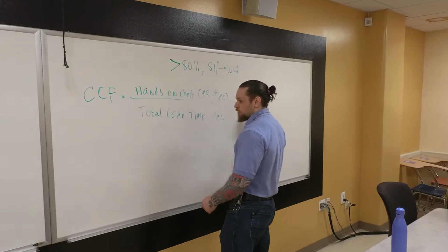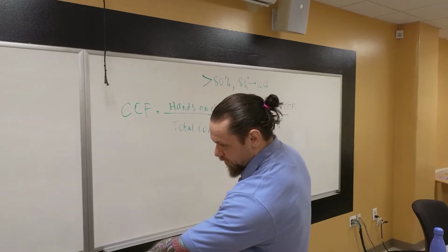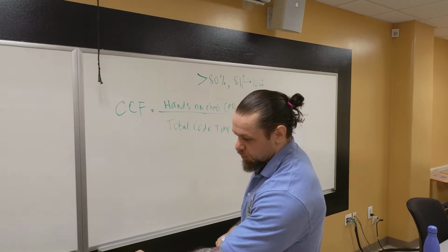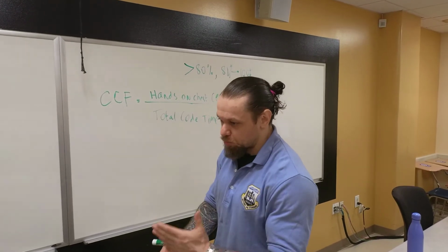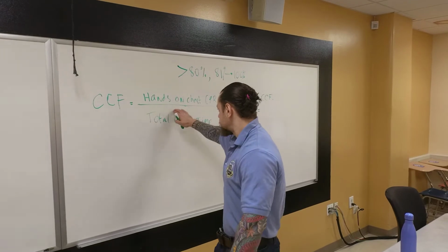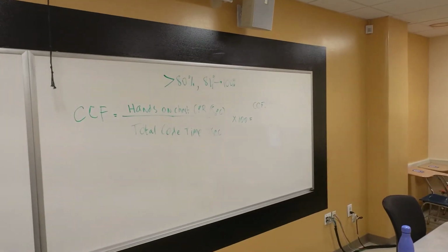CCF fraction. What I'm going to do is this. I'm going to run my stopwatch on my phone, and then we're going to run this on this monitor, and we're going to see, basically, do they match. I think this number is going to be higher, because it also factors in how deep, how good is the recoil, hand placement. I'm just assuming every compression is good, where this one may give you something else. We're going to calculate this out, and we'll see. So Angel is the team leader. You got all your assignments. I'm going to put this into the CPR only mode.